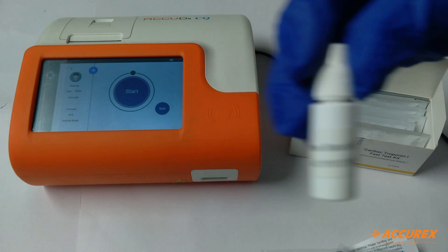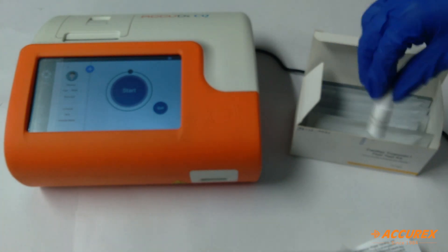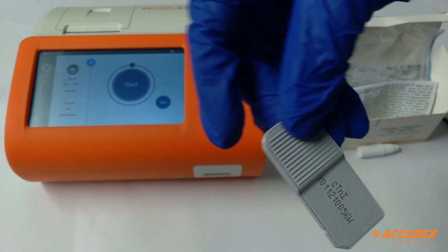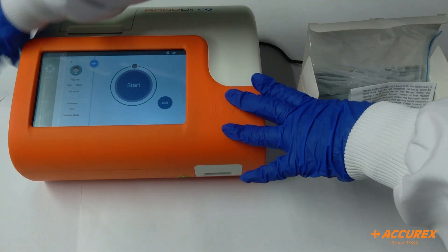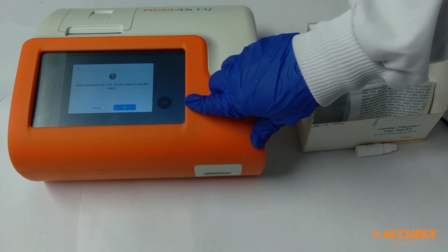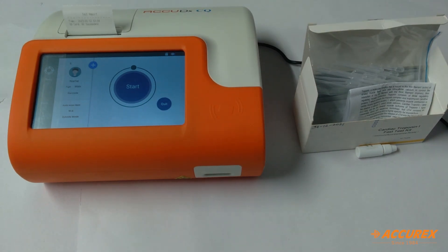To test the whole blood we use this blood buffer — when we use whole blood we'll put one drop of this buffer. First we'll insert the SD card that comes with the kit. There is a slot on the left side of the analyzer for the SD card. We'll insert it and a notification will pop up; we'll click OK and it will show 'SD card QC succeeded.'